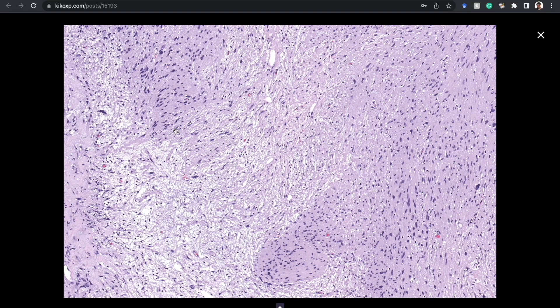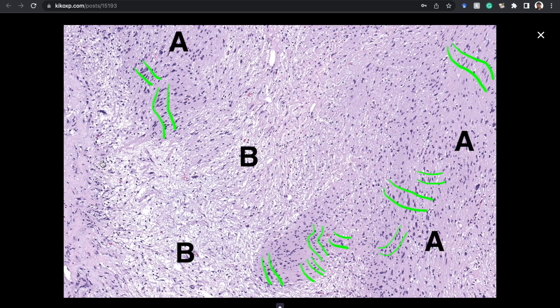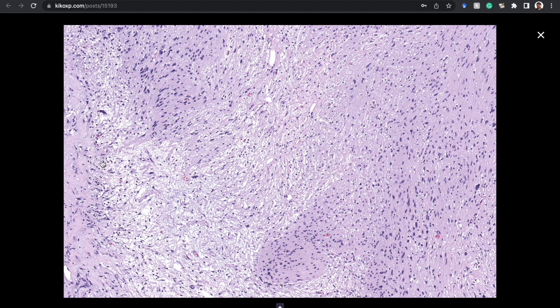Can you see it? Can you appreciate how those lined-up nuclei are there? Over here it's a little more subtle, but with practice you can begin to see it. Going back and forth — yeah, there is kind of a line of cells right down here and right down here. They don't always orient the same direction, they don't always look beautiful. They're not as pretty as Verocay bodies — people don't always photograph this kind of stuff and put it in a textbook, because why would you when you can get a gorgeous Verocay body, one of the most lovely-looking structures in human neoplasia, and benign too.